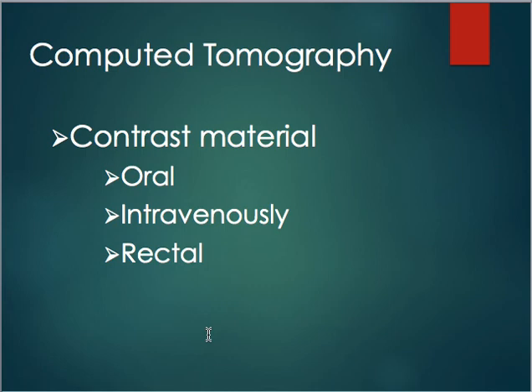Now, it's even more prominent in CT because we use those power injectors, which means it's injecting it at a faster rate. So the reactions are going to be a little bit more intense. So it is vital that you inform your patient that those are some of the side effects, just so they don't freak out or get nervous. So again, and I said this before, it's important to tell them what the normal side effects are so that they know if there's anything abnormal going on.